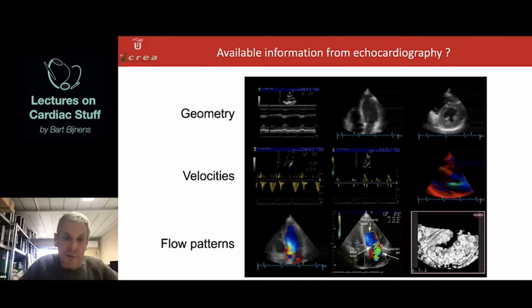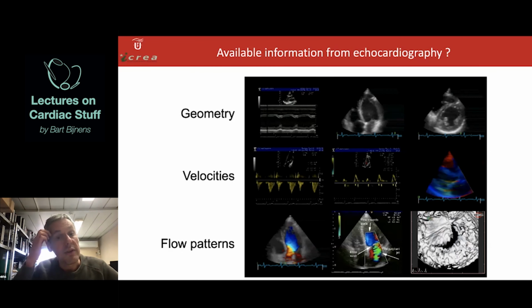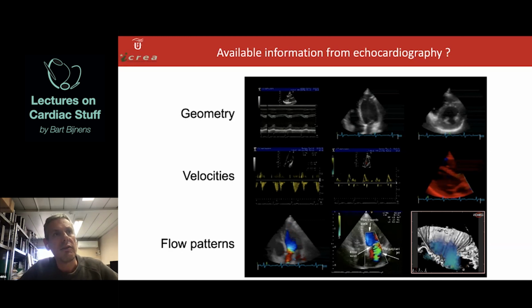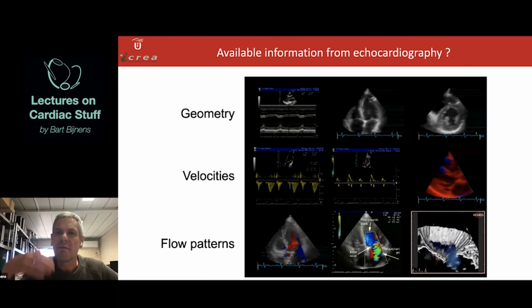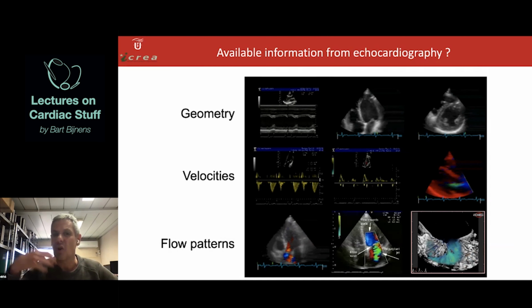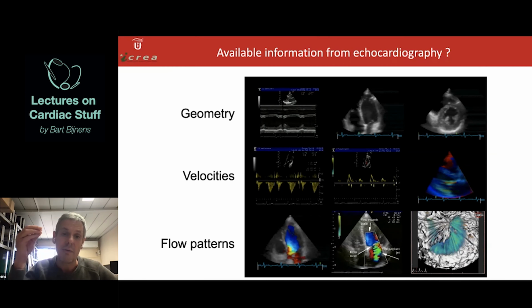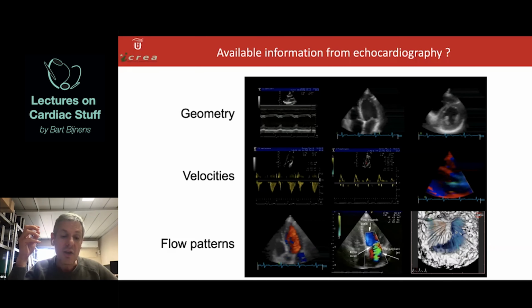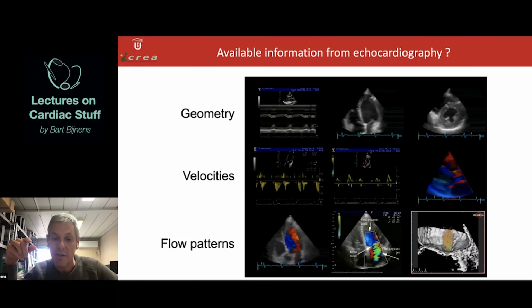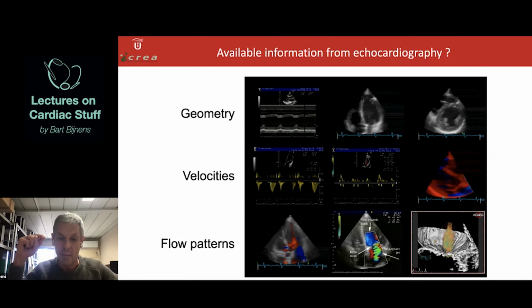A very, very useful tool, as I said before, is Doppler, and that's what we're concentrating on today. When you look at the cardiac literature, Doppler is not sexy nowadays because a lot of people perceive it as old. But in clinical practice, it's very, very important. And there's actually a huge amount more information in the real detailed dynamics of the Dopplers than is mostly used in current clinical practice.